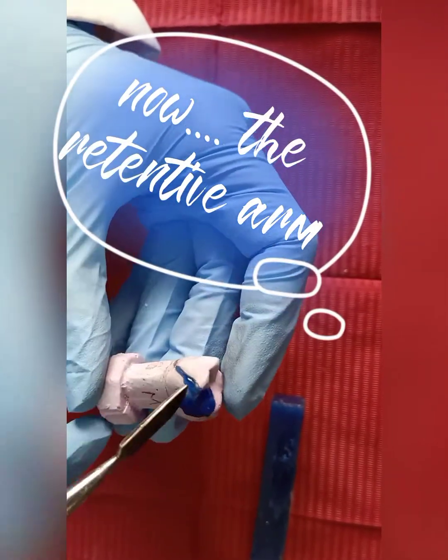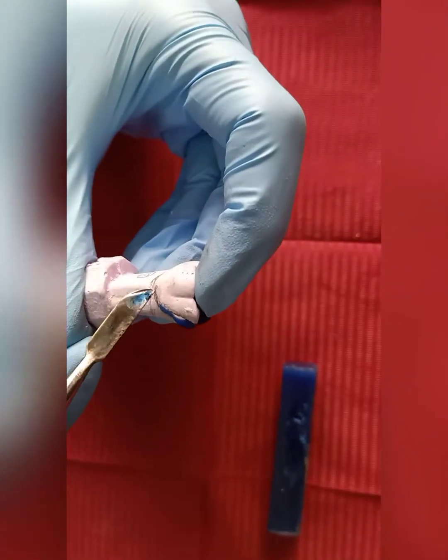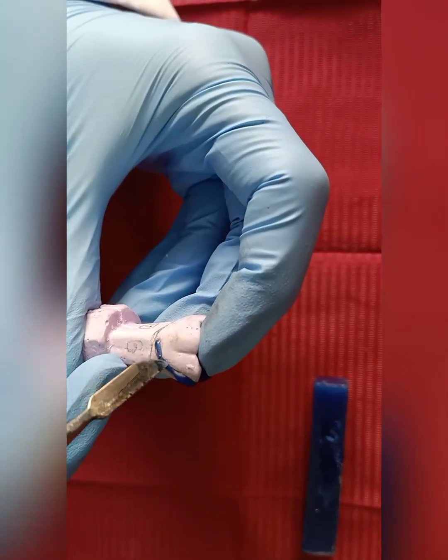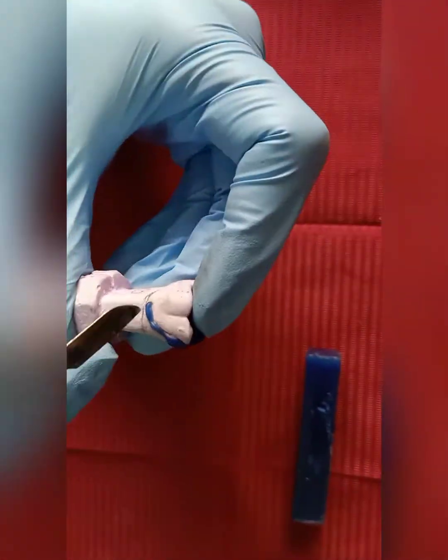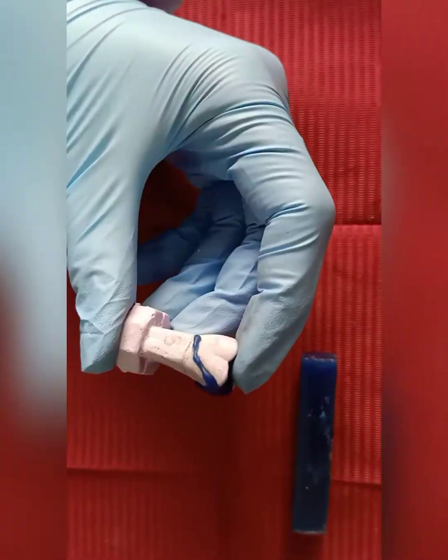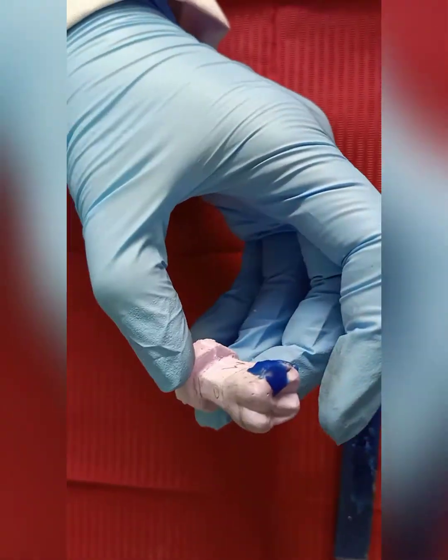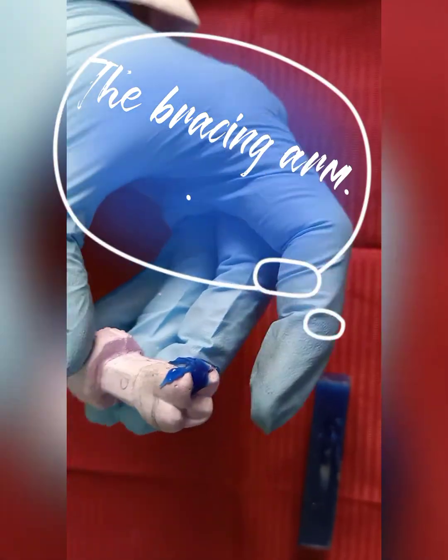Now the retentive arm. Don't add too much wax, just on your drawing. Now the bracing arm.